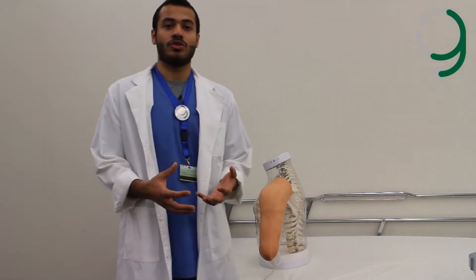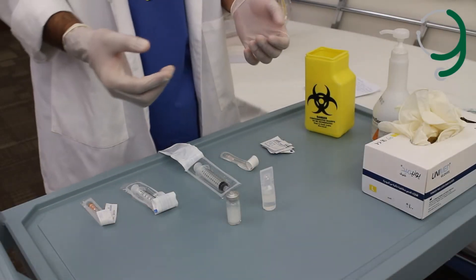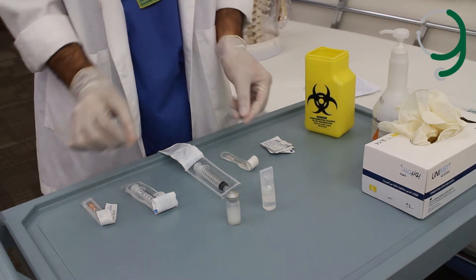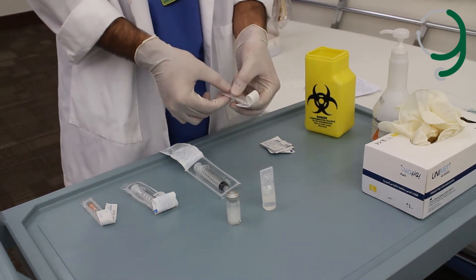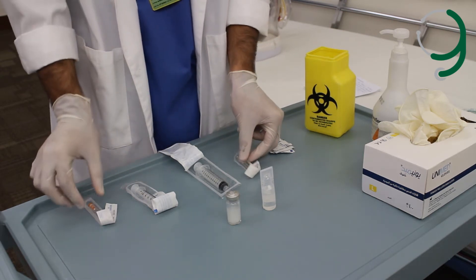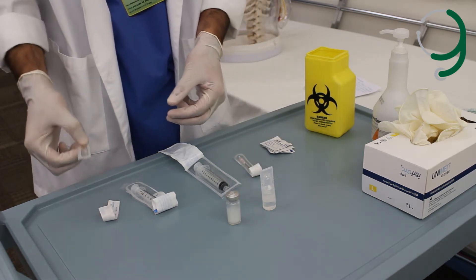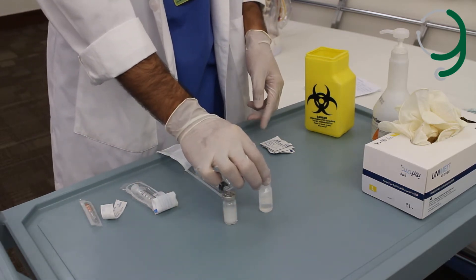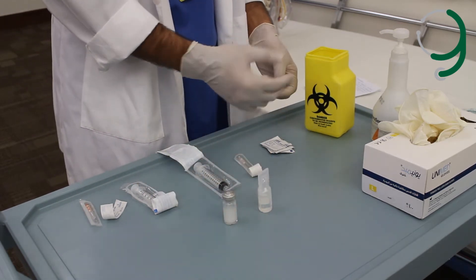Then we'll wash our hands and wear the gloves. After we've washed our hands and worn the gloves, we'll make sure we have all the equipment. We have the syringes, the 23-gauge needle for the intramuscular injection, the 25-gauge needle for the subcutaneous injection, a vial, an ampoule, alcohol swabs, and the sharps container.